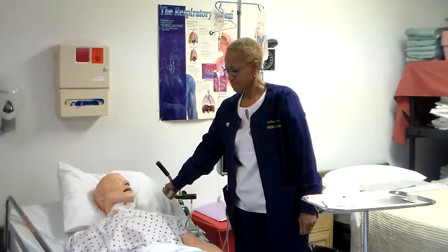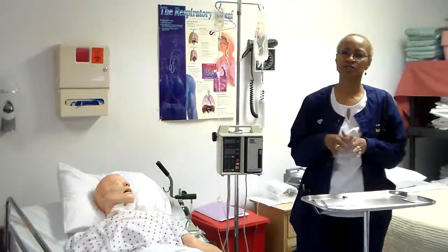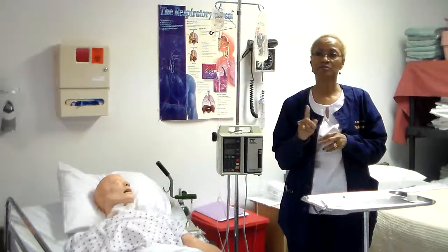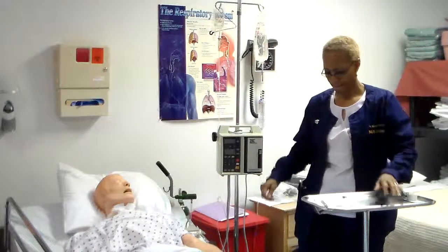Mini infusion administration. You'll need to review your textbook for this. Your mini infusion, the book gives really nice pictures of different types of pumps that we actually don't have available in the lab, so please make sure you review those. You will not be checked off on those, but it may come up on your exam, so please make sure you're familiar. Ask client to explain purpose and side effects of medication.